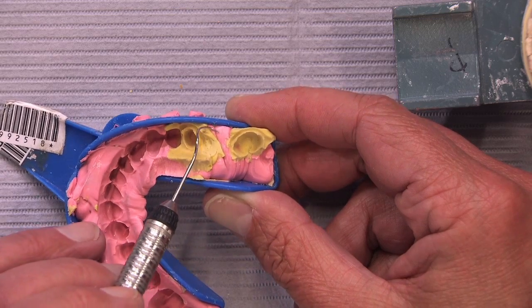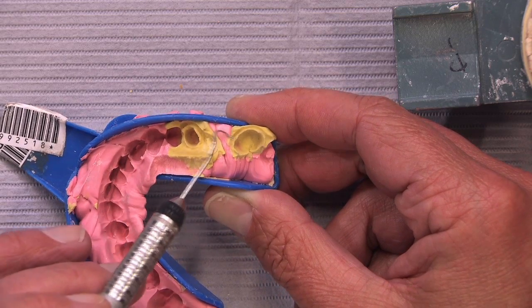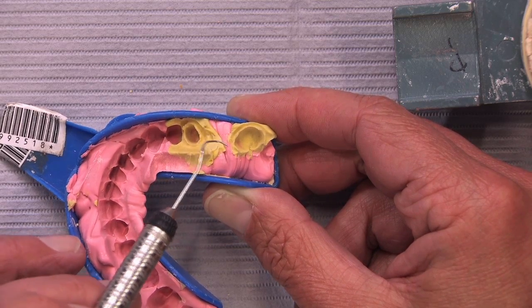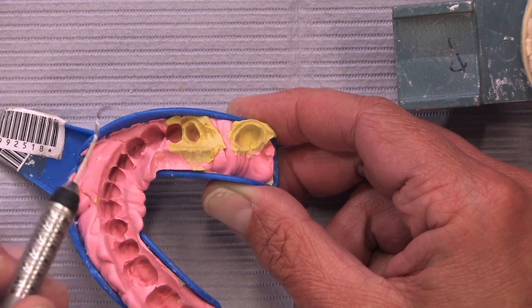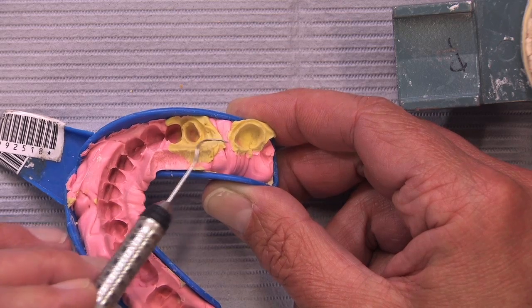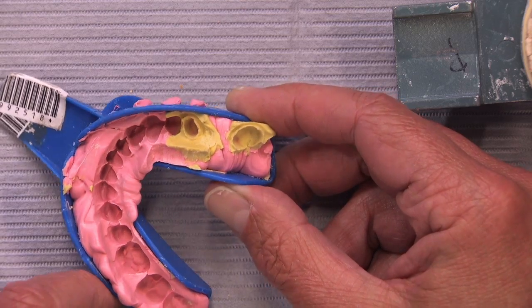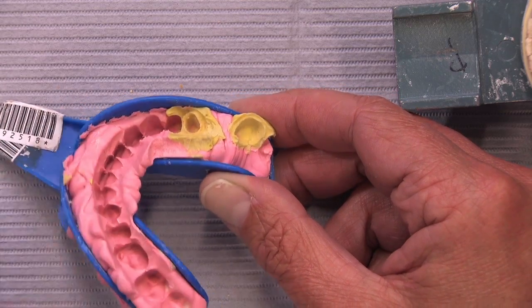Well, there's several issues here, but one of the issues is we don't have this yellow material contiguous between these two preps. And so as a result, when we make this BruxZir bridge, the bridge is going to be high and dry away from the tissue and could very easily pack a lot of food underneath it because we don't have a registration of what that ridge actually looks like. And that's one of the reasons why we're going to have to send this back to the doctor and ask for another impression, because we're going to end up really high and dry here.